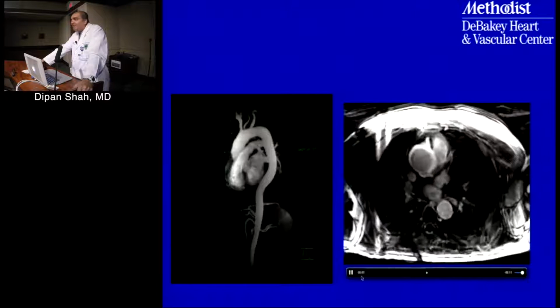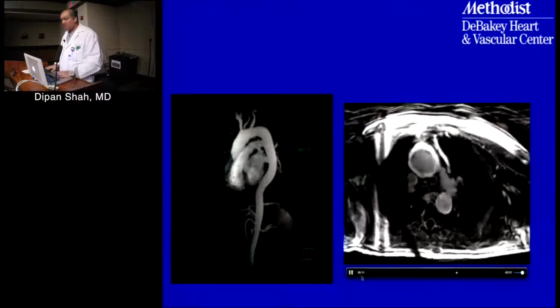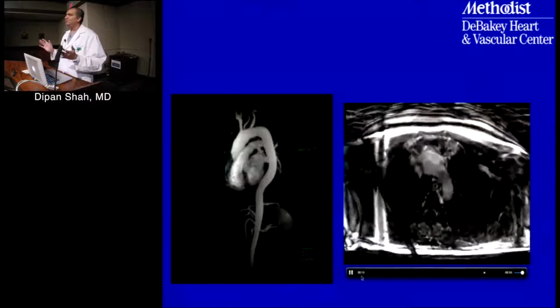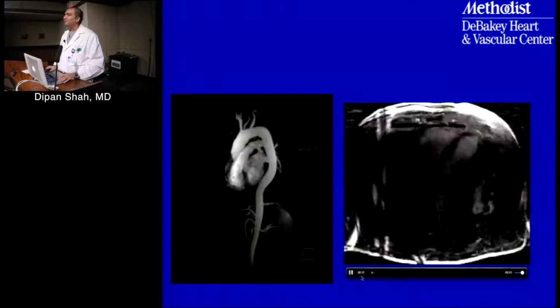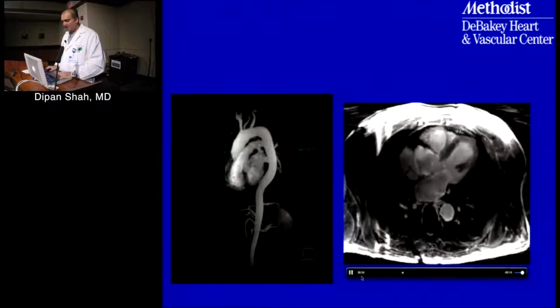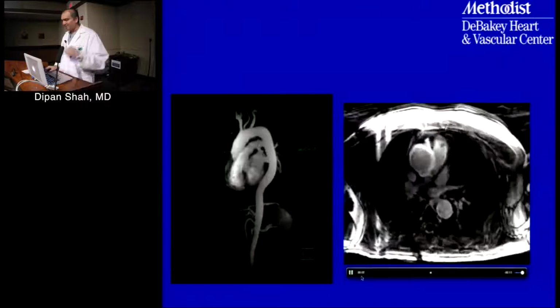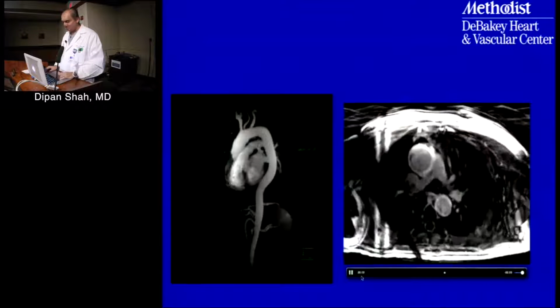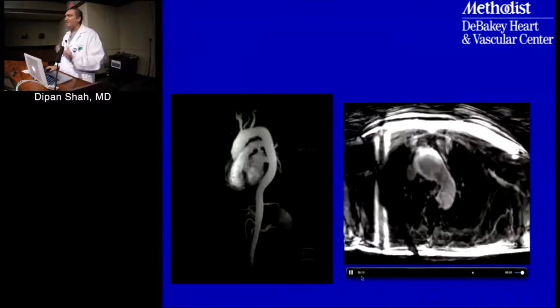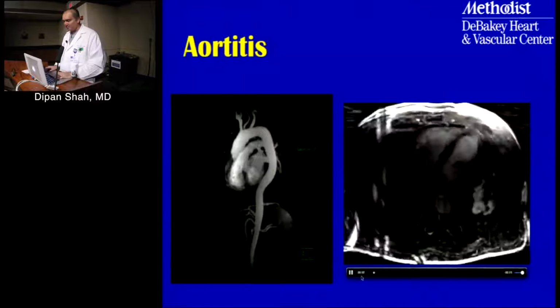But I mean, an asymptomatic person. So that's the interesting finding. Yep. And then there's really no right. So the workup didn't reveal anything. Yeah. But obviously, this is probably the most remarkable case of aortitis that we've come across. With a lot of these vascular diseases, some of it's pattern recognition. So having seen a case helps when you come across another case in the future.